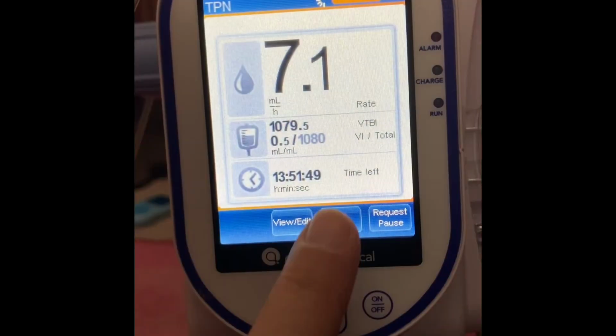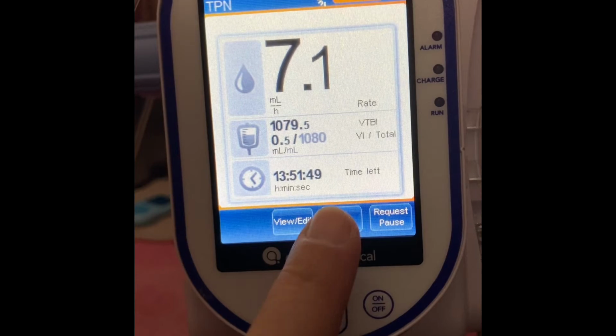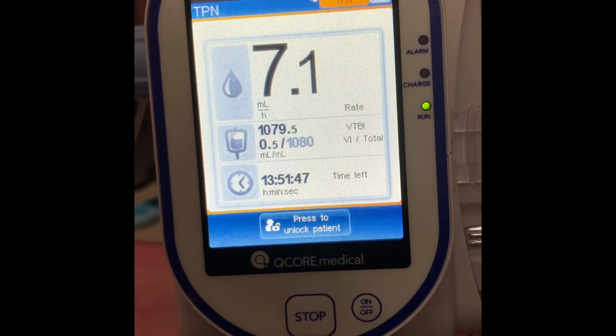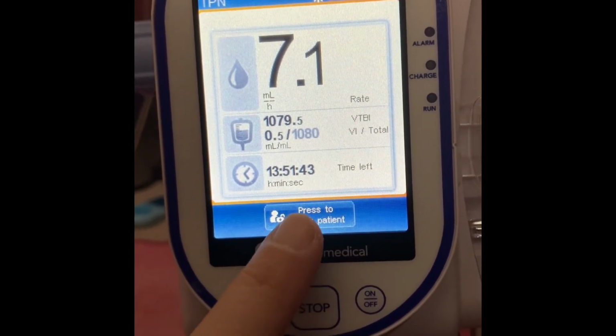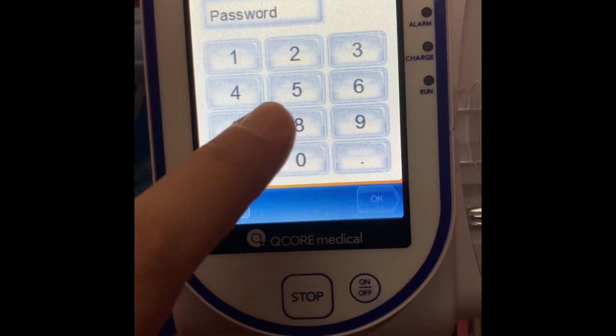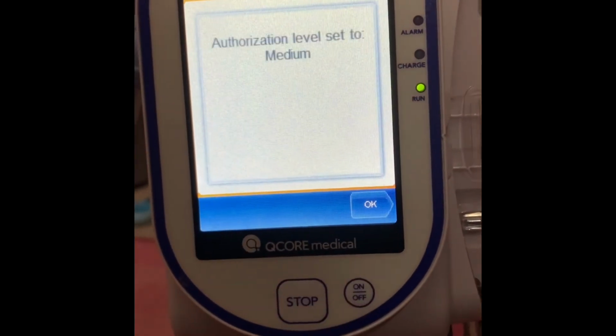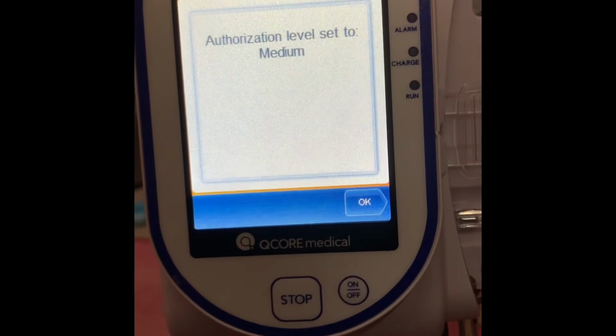Here's how to lock and unlock the screen for when you put the pumps in a bag. You press lock, patient lockout, and then when you want to unlock, just press that, 8880, enter, and then that is how it is unlocked.